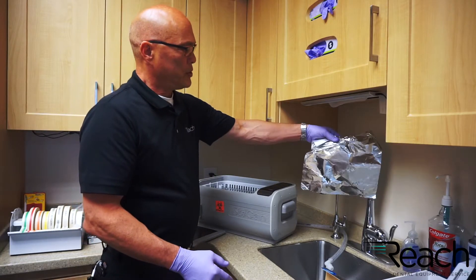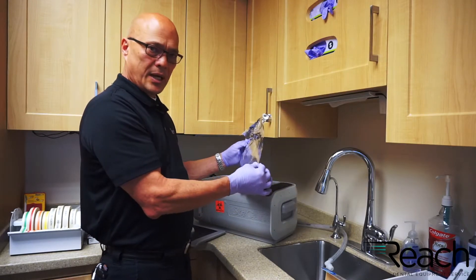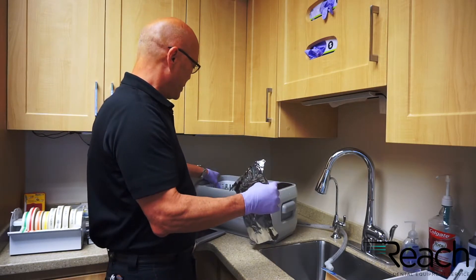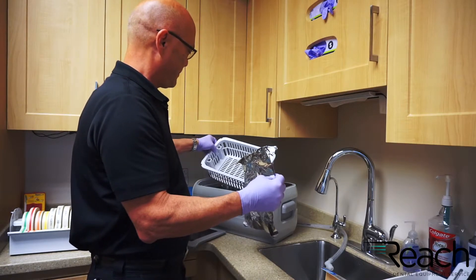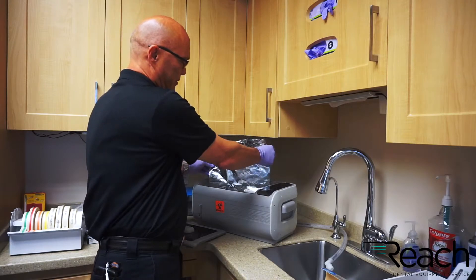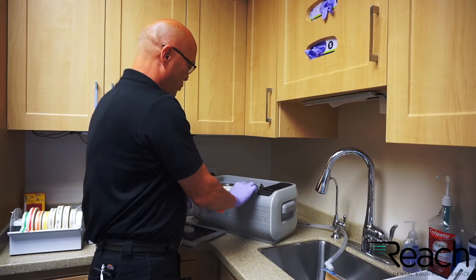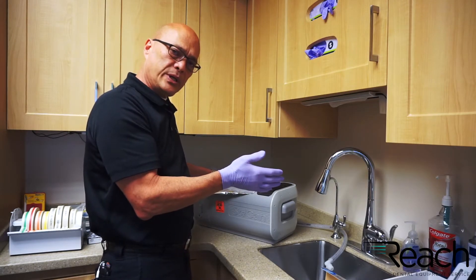To test it, you should take a piece of aluminum foil — just a thin grade, nothing special, no heavy grade — just thin grade. Take the basket out and place a piece of foil diagonally from corner to corner, then run it for about five minutes.